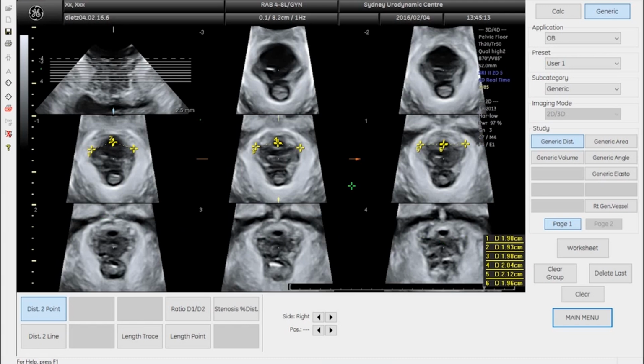It's just that you do need those three slices, the three central slices, to determine the minimal criteria, that is, whether this is a full avulsion or not. It's obviously not. Incidentally, also, further up here, you can still see the sonolucent symphysis pubis in the middle, the disc between the pubic rami, between the os pubis left and right, and this here is the acoustic shadow that you get from the pubic rami.